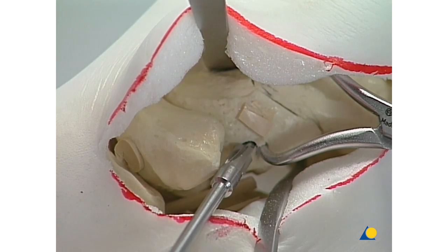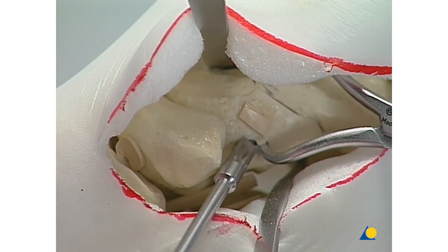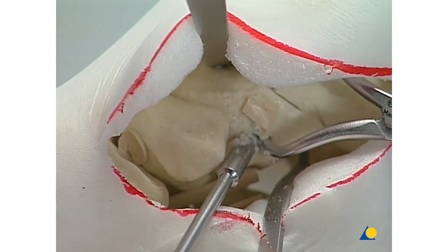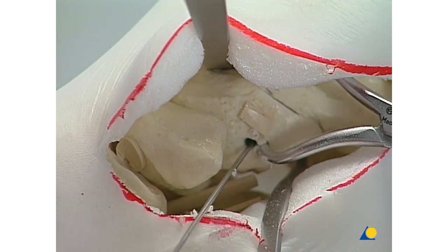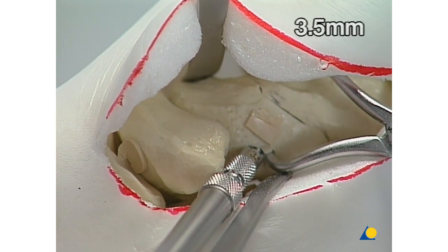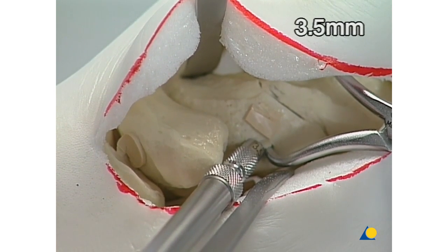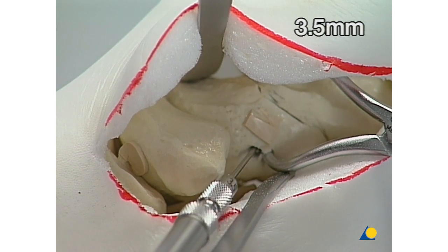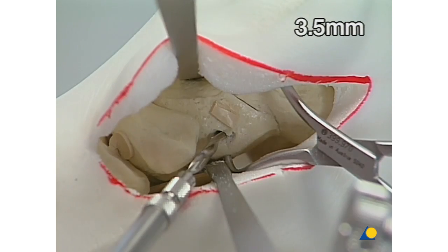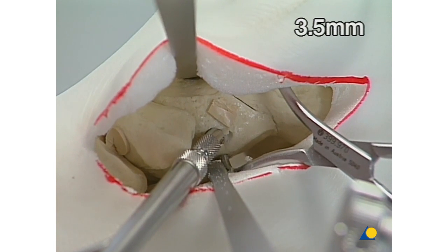Countersink the hole to accommodate the head of the screw in the cartilaginous layer of the talus. Tapping of the drill hole using the 3.5mm cannulated tap. The first fragment will be over-drilled using the 3.5 cannulated drill bit.